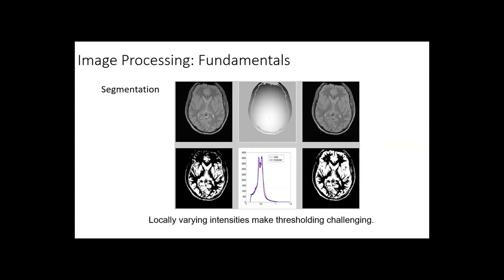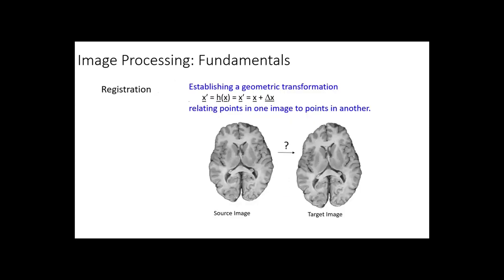You're going to see the image has some parts very bright, some very dark. In the MR field, we call this a bias field. So when we do the segmentation, you have to simultaneously estimate this lighting condition, to regress this lighting condition out, then we can get a reasonable tissue segmentation result.